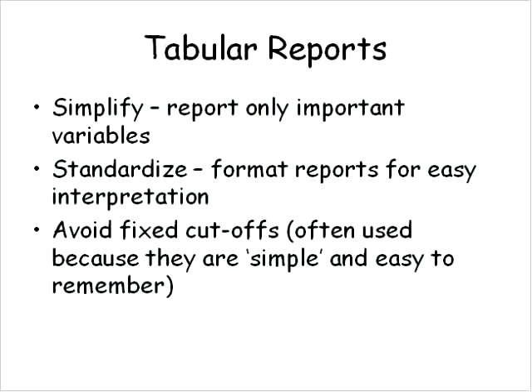One of the aspects of that I think is important but often overlooked is how that data is presented. In many instances, that data includes fixed cutoff values because those tend to be simple and easy to remember. But just the fact that all of our systems are computerized should tell us that we don't need to rely on simple, easy to remember fixed values if a more accurate way is available. And again, my suggestion to you would be that looking at things other than fixed cutoffs may be the way to go. And we'll discuss that in a little bit more detail shortly.